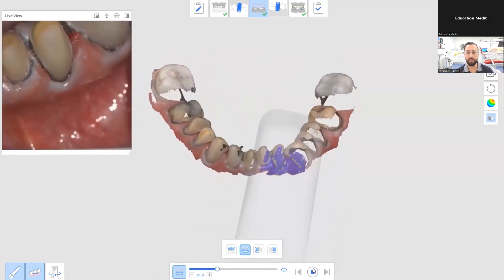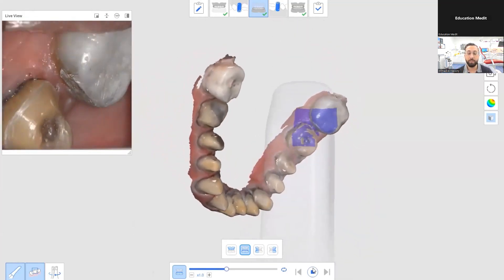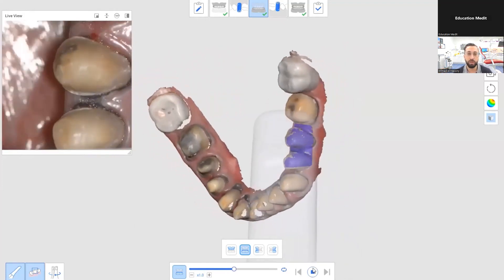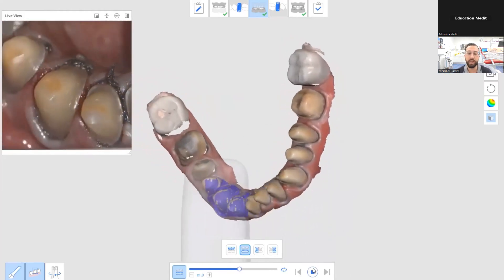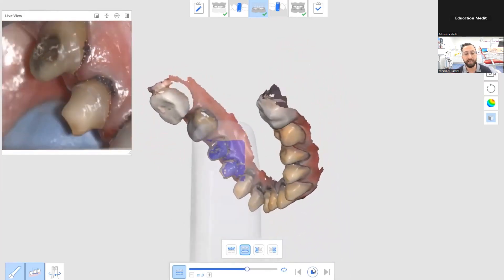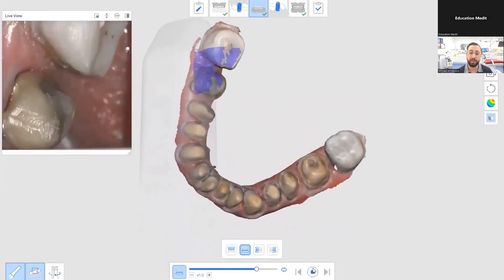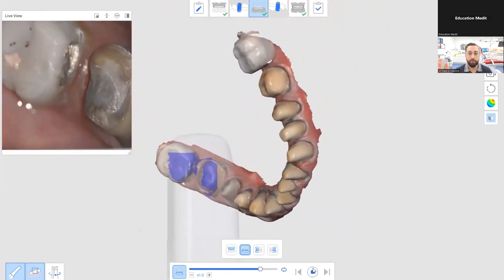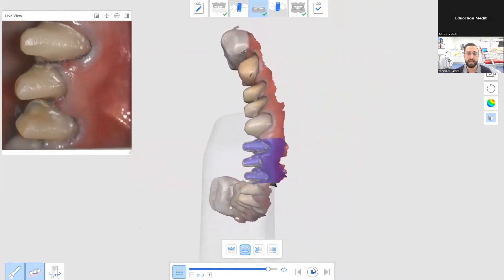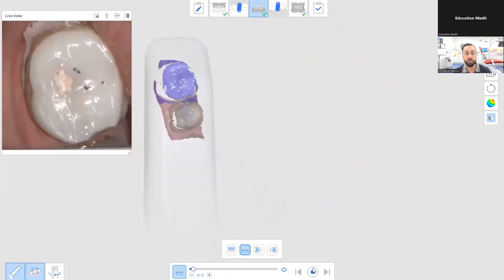One thing I get asked often is: do you keep the retraction cord in during scanning? Yes, always. You should never pull out retraction cord to take your scans, because the moment you pull it out, you will get bleeding — I don't care how healthy the gums are. Bleeding is the enemy of scanning. Always keep the retraction cord in, and pack it properly so it's not flopping around or over the preparations. Some retraction cord on the lingual aspect not packed all the way is fine, as long as it's not in the way of the preparations.